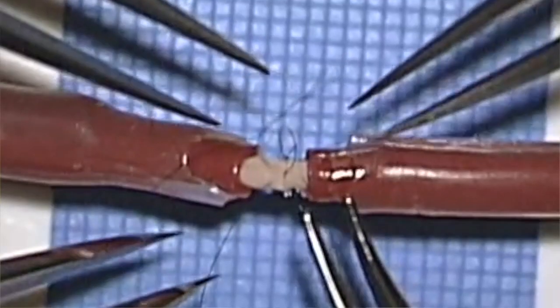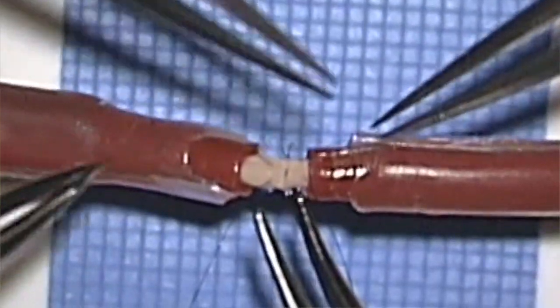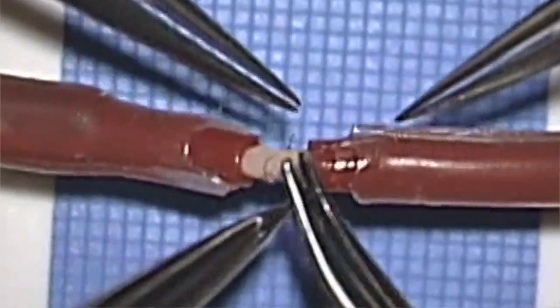The other thing that I found at the time of doing the surgical operation was different tricks to help ease the difficulty with microsurgery, because it can be an overwhelming thing. So one is having a very good assistant, which you were, and that allowed, in terms of you presenting the lumen of the vessel, particularly the artery and even the vein, which can be a bit more challenging. That made it so much easier in terms of doing the micro. The other technique that I also learned included the fact that you presented the end of the suture to me as well. That made it easier to do the tying of the knots.